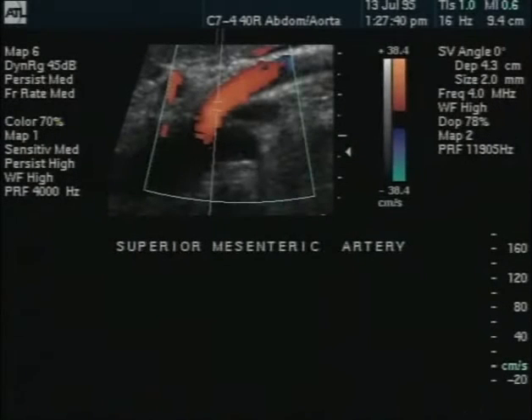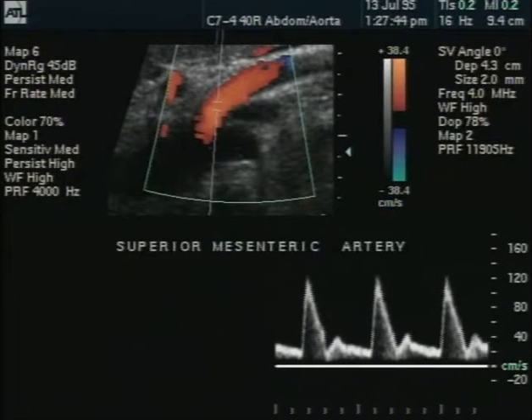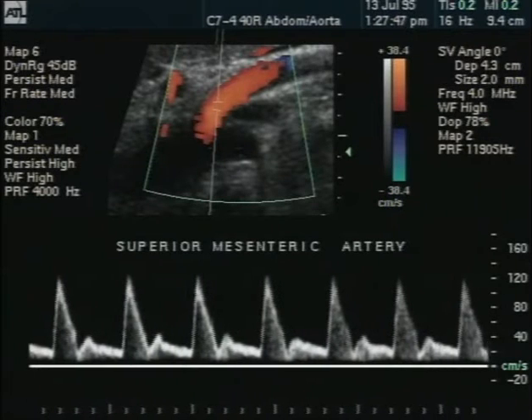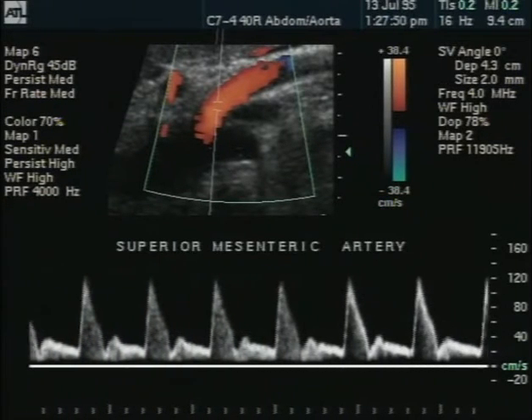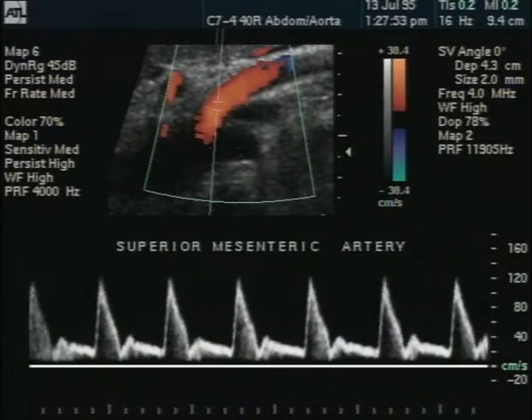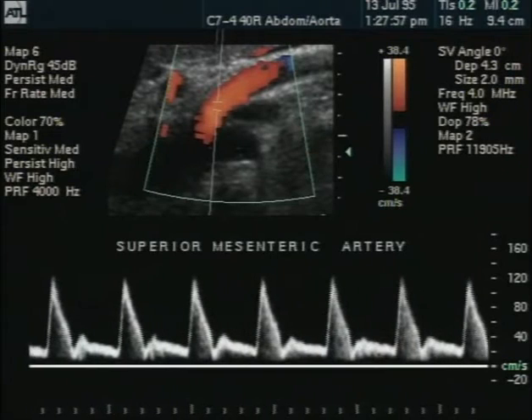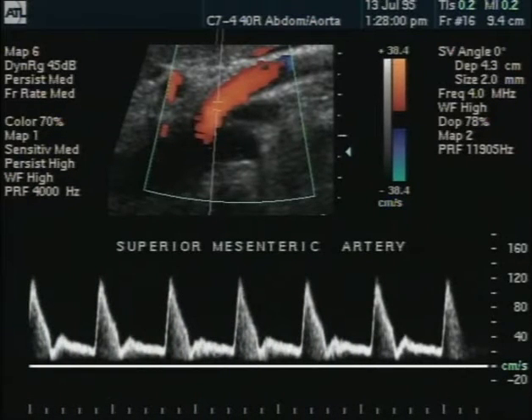The SMA waveform, like the waveform from the external carotid artery, will exhibit sharp upstroke in systole, rapid systolic deceleration, and low flow throughout the diastolic portion of the cardiac cycle. There may be flow reversal in late systole in this vessel, which supplies a high resistance end organ.